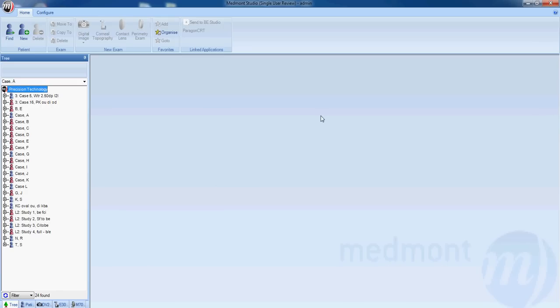You will note that your database is along the left hand side. All patient information will be stored here.